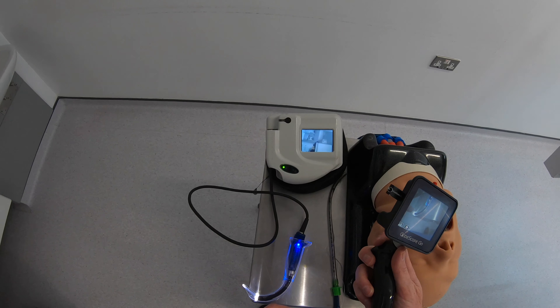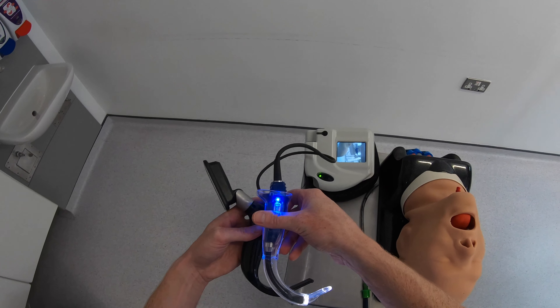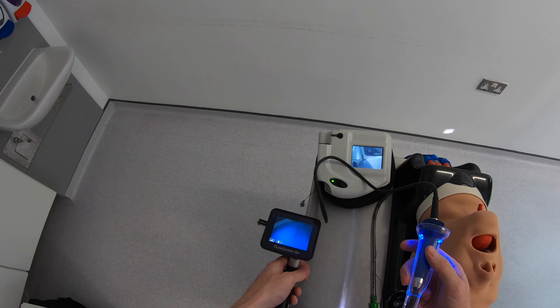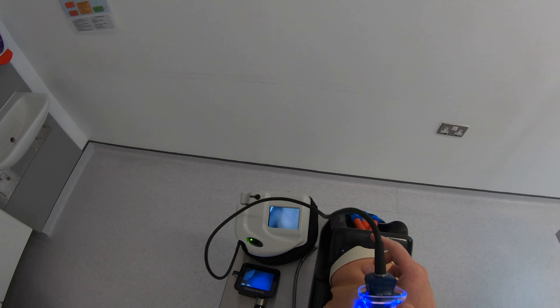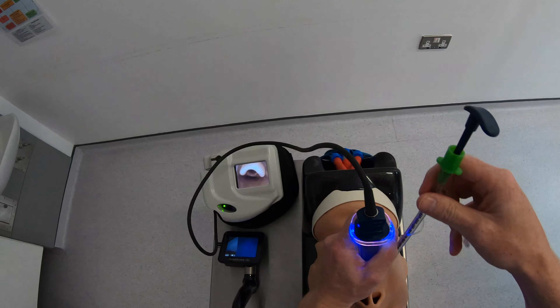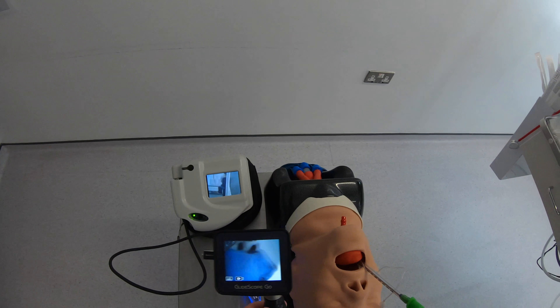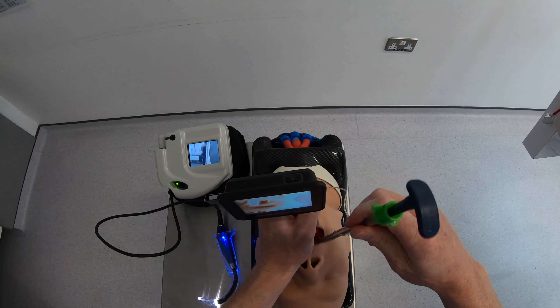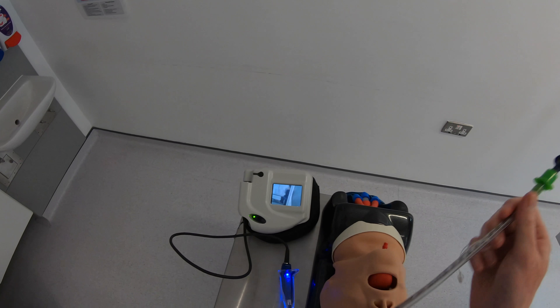Now let's compare the Glidoscope Go against the Ranger using the bigger blade — we've got a size 3 blade loaded up on each system. You can see the real advantage of the titanium spectrum blades here: just how much thinner they are compared to the older AVL system, which makes a real difference when you have a patient with limited mouth opening. Starting with the AVL system on this difficult airway model — you can see the cable getting a little bit in the way, though we have no problem getting a view and passing the endotracheal tube. With the Glidoscope Go, I get a similar view but I do have a little bit more space in the mouth for passing the tube.